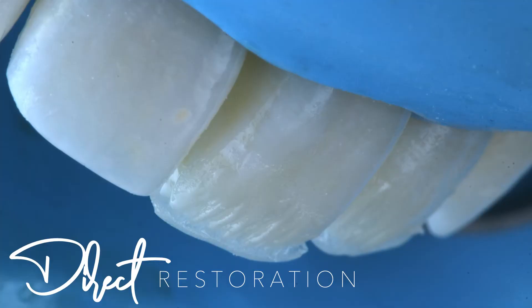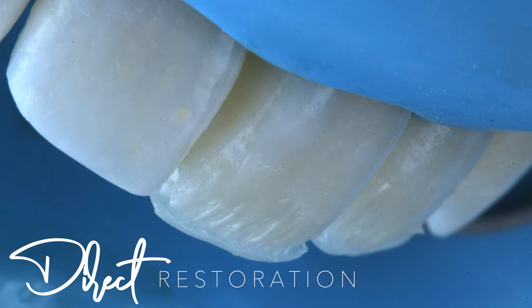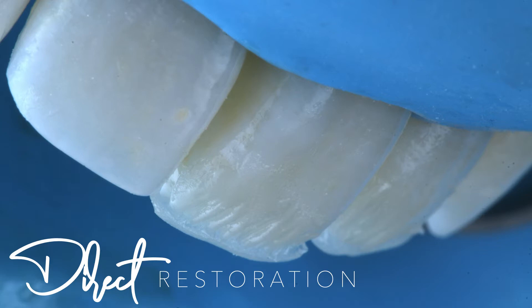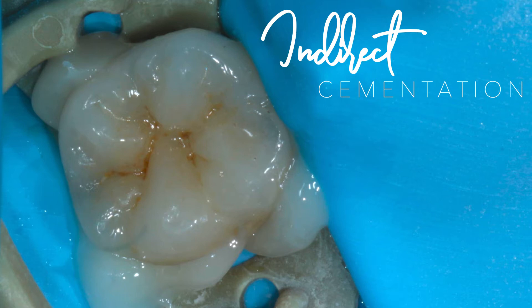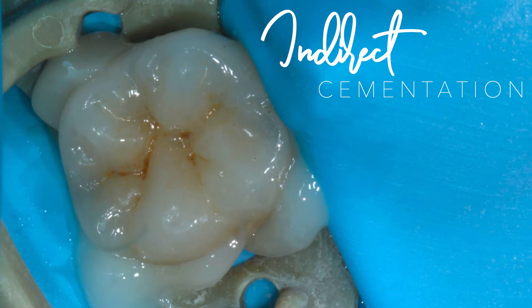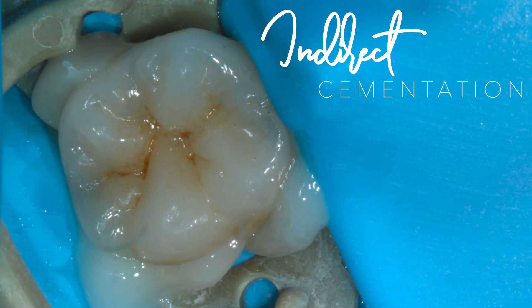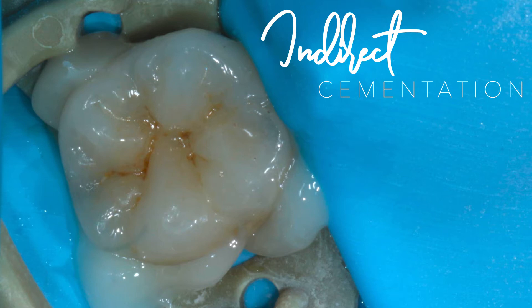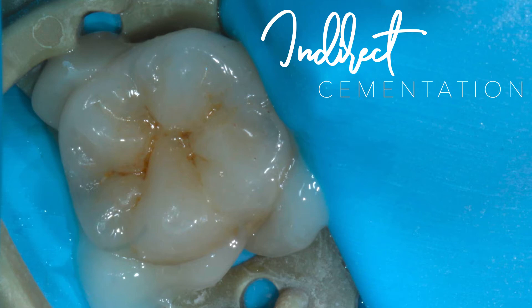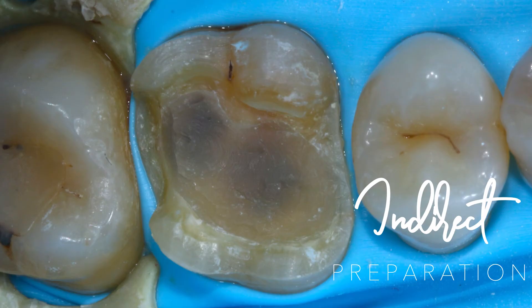More and more as I do anterior work, my workflow with rubber dam is becoming more simplified. I ensure I'm using rubber dam for all anterior restorations, and since we're using resin-retained indirect cements, the technology is the same — so there's no reason not to use rubber dam for indirect cementation, particularly if it's adhesive-based. A dentist once questioned whether I use rubber dam for cementation; the answer at the time was no, but they said if you're using the same technology, why wouldn't you? From that point I've been using rubber dam for cementation as well.